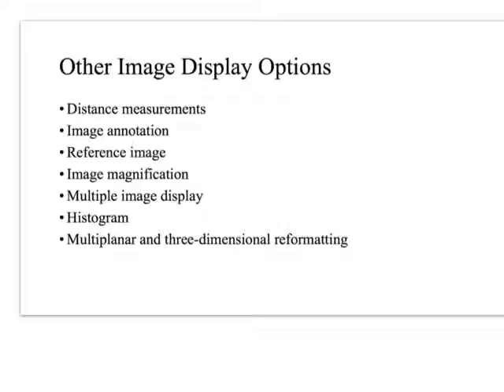Like if I'm putting an ROI on the aorta with contrast in the aorta, I want to make sure that it's right there in the contrasted aorta to get an accurate measurement. If I'm sampling, again, material in addition to the contrast, I'll get a larger standard deviation.